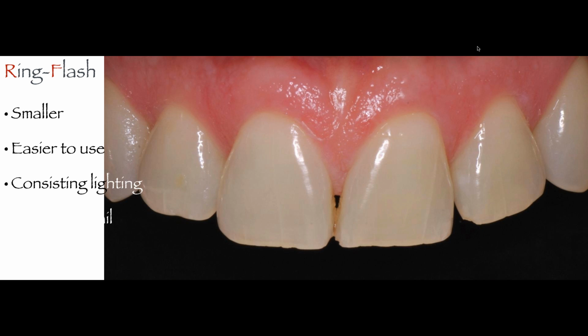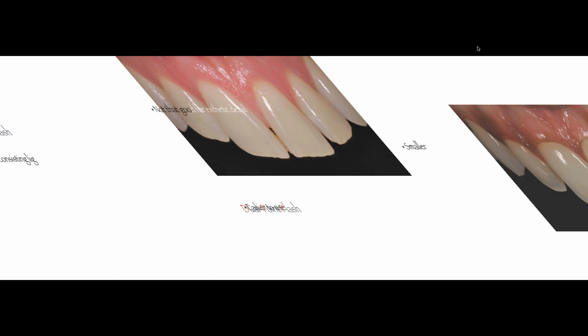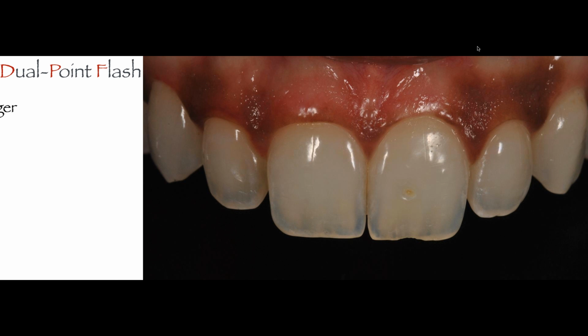It's easier to use. It has a consistent light. It's always the same amount of light coming out, so you're going to get consistent photos, but it's not good for aesthetic detail. And I'm going to prove that to you. See, this is a photo that I took from a patient.